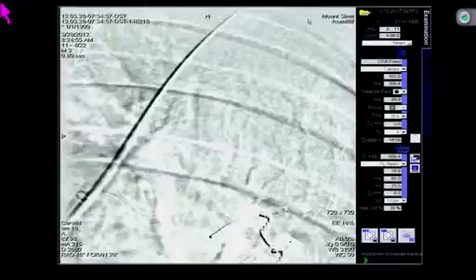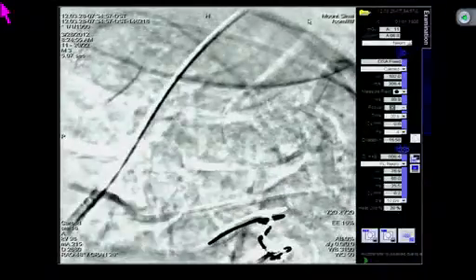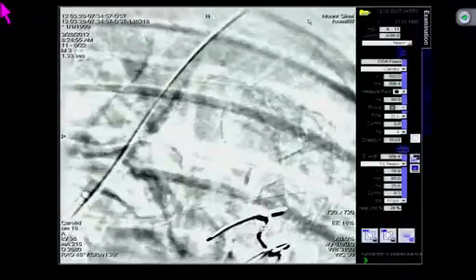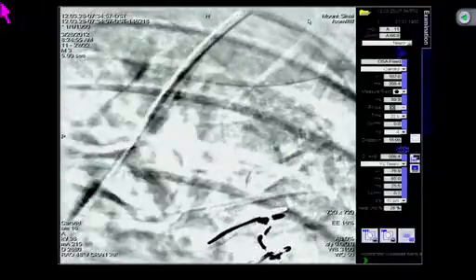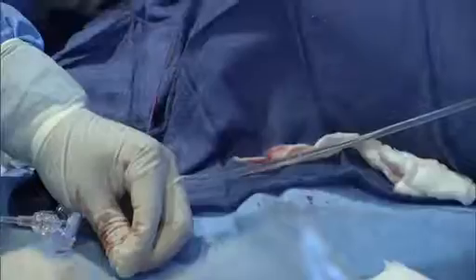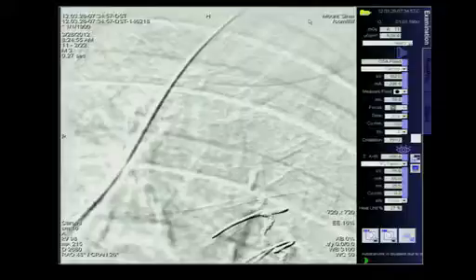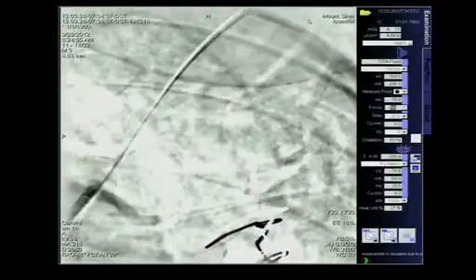Maybe she's breathing too much. Maybe you want to switch to the coronary view from now on because we can't really see very well here. You got it. So let me get a 6 millimeter balloon, guys. I do serial balloon dilatations here, George, because I want to be able to really expand this. I know I got a 4 down, but I had a lot of trouble pushing a 4 in.